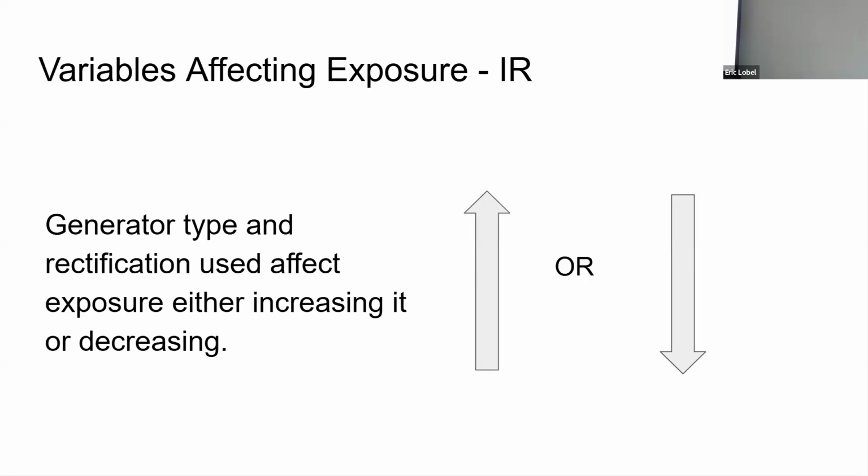So the DI is a better EI. What I mean by that is the EI, exposure indicator that we've talked about a lot in our lab, has a certain range, but that range is different for manufacturers. The DI, which we talk about more in another class, was an attempt that worked to use a formula that will take 10 different manufacturers and all their different ranges and convert it to one DI range, deviation index, that everyone understands. So you don't have to walk around with something in your back pocket if you go from one job to a part-time job or whatever. We're all hustling up there.